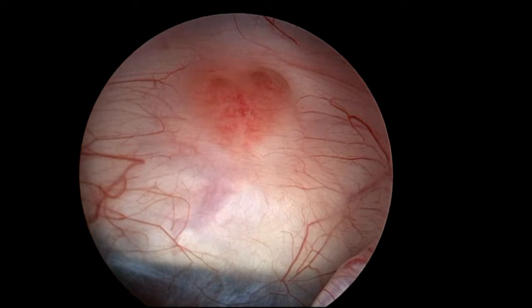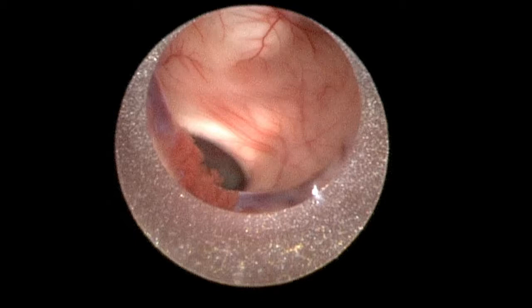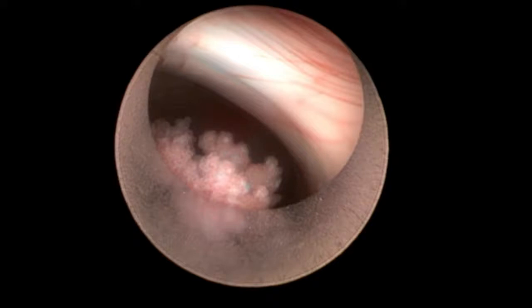First, the diagnostic scope is introduced into the third ventricle to visualize the floor with the infundibular recess and the mammillary bodies. The floor is very thin and translucent. The endoscopic sheath is introduced carefully via the foramen of Munro into the third ventricle, avoiding damage to the fornix or choroid plexus.